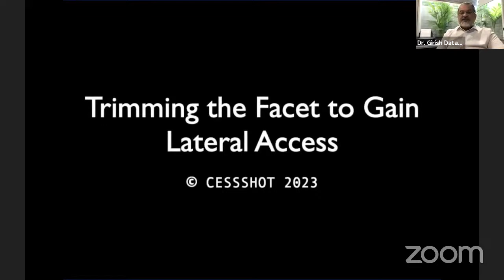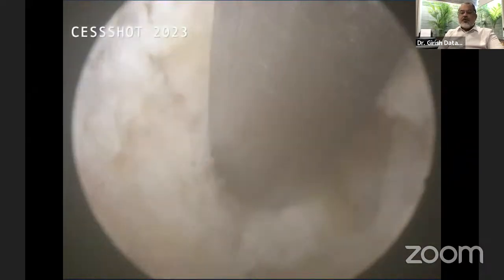Once the bone is identified, the first thing that we do is start trimming the inferior articular process. Use the smallest kerrison that you have and gradually start trimming bone under vision. Most of the time in full endoscopy, you don't see much bleeding, though you may encounter it, and you can very easily stop it. You are able to see a very nice clear field because of the constant irrigation. So you first trim the inferior articular process from cranial to caudal. You may alternatively use a small hooded burr; 3 mm, 4 mm and 5 mm sizes are available for you to remove bone.